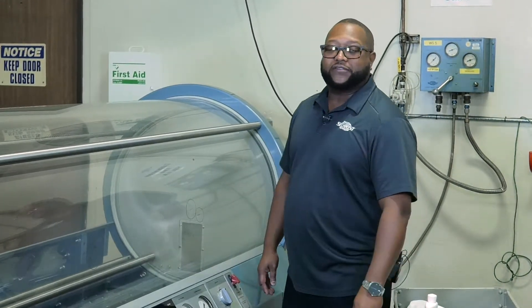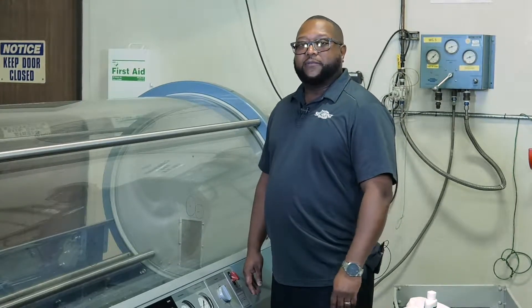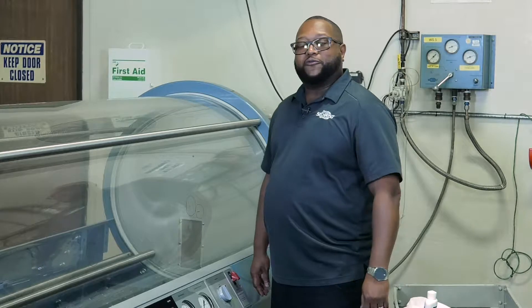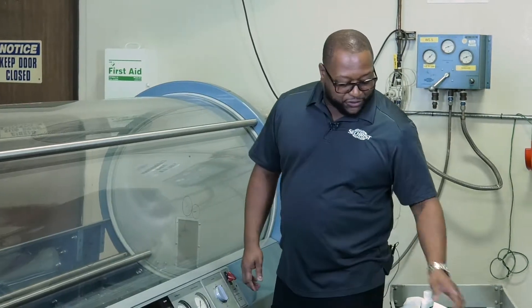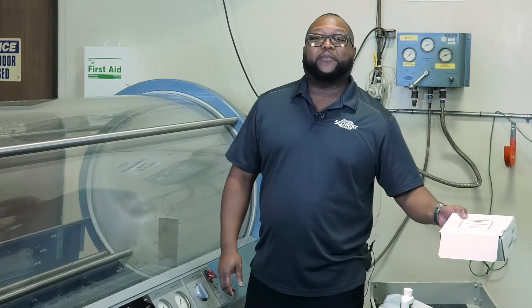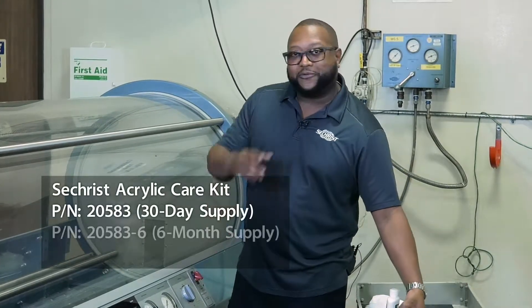Hello, my name is Scott McKinney and I'm a field service specialist with Sechrist Industries. Today we're going to talk about acrylic cylinder care. The best way to prevent grime and residue from accumulating on your cylinder is to use our acrylic cylinder care polishing kit, which can be ordered — the part number is listed.